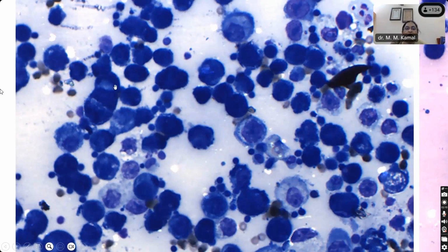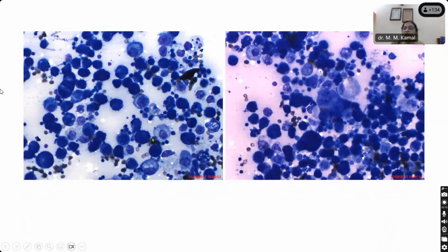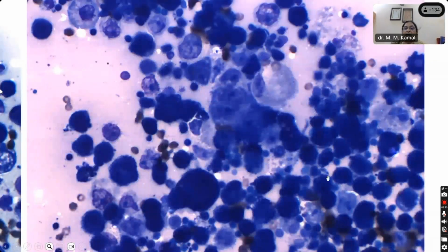Here again, you have these bad cells, but what you have is this vertebra-like arrangement. There is articulation of these cells and vertebra-like arrangement with little clefts in between. So you feel that they could be malignant mesothelial cells? Yes, ma'am. That could be malignant mesothelial cells. So these are examples of highly malignant mesothelial cells.